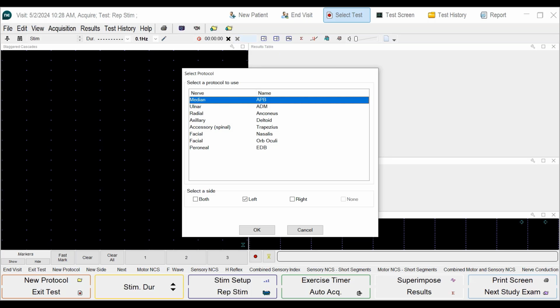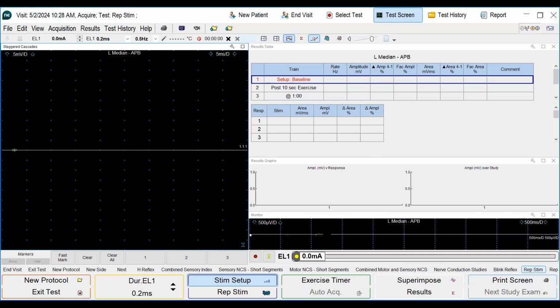So we need standard placement of electrodes, just like we are doing a motor nerve conduction study. This is where I like to place the stimulator on the patient and make sure it doesn't move, because this test usually is going to take about 5 minutes or so. I don't like to use the probe, especially if I'm going to do the distal limb studies. Sometimes putting the probe on can be challenging, holding it in place.